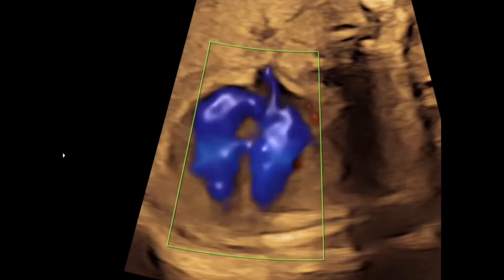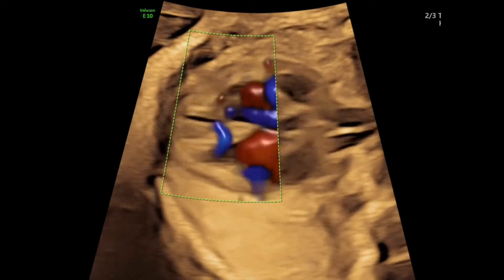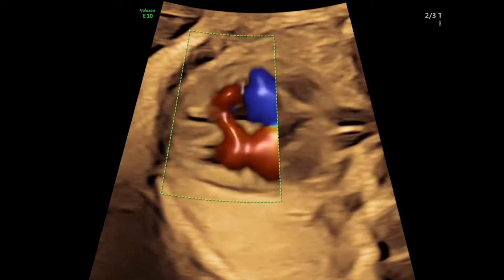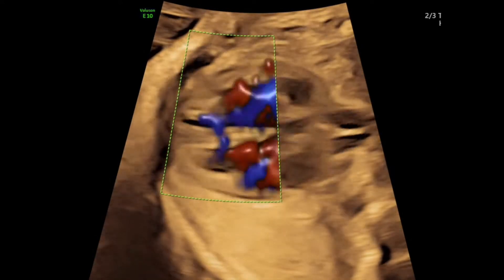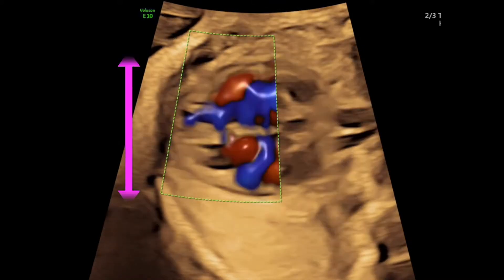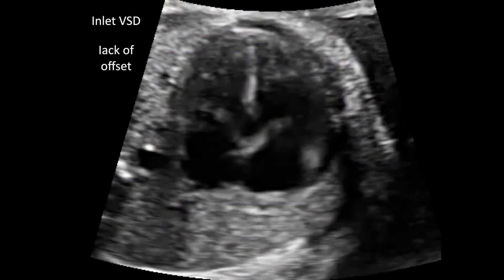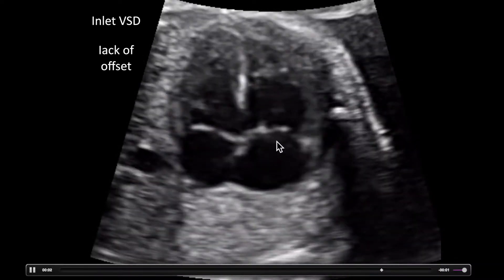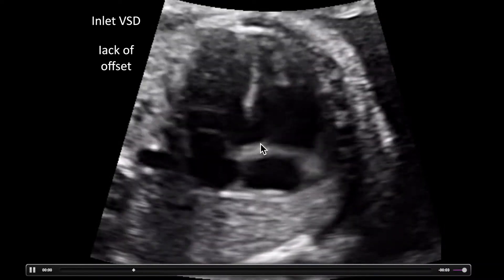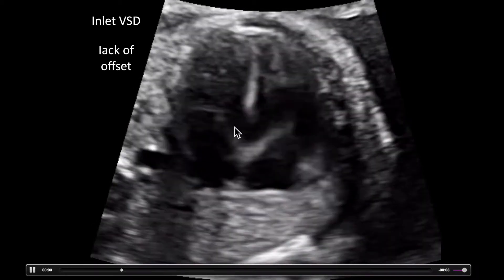This very same fetus imaged with the apex towards the side shows a clear mid muscular ventricular septal defect. Remember, with inlet VSDs your first tip-off is the lack of AV valve offset, as well as potentially a visible defect.